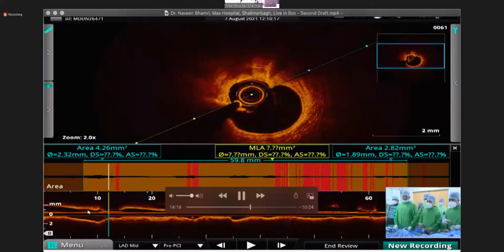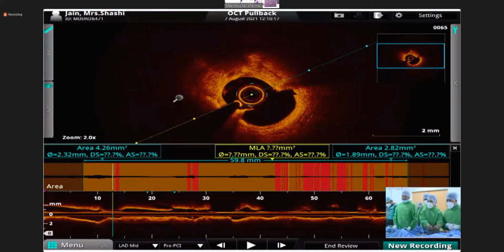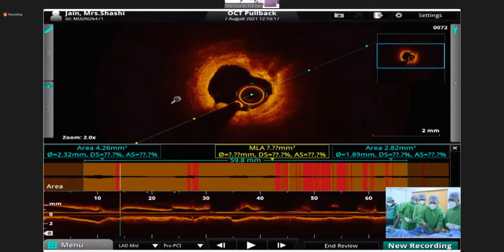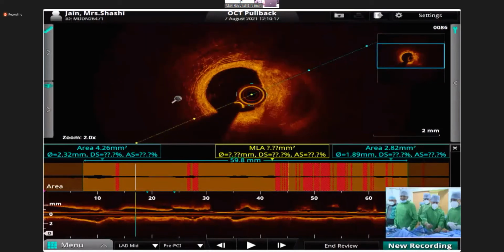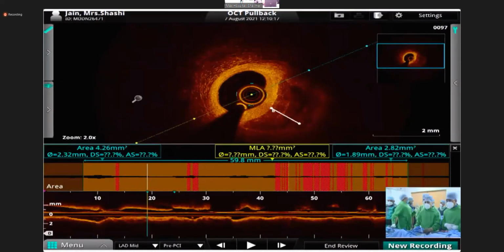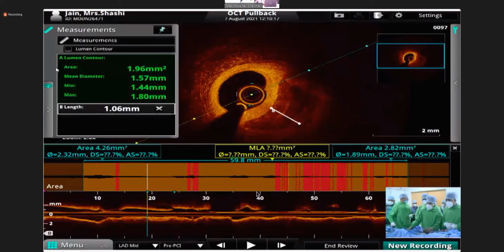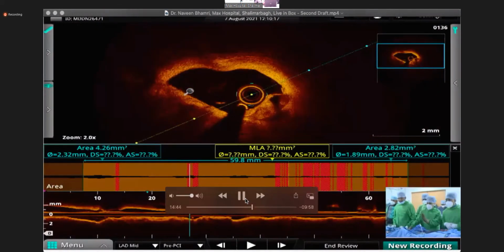You can see the dense calcification from the 9 o'clock to 3 o'clock position. Now you can see the dissections. You can see the length of the calcification is more than 5 millimeter. Depth is approximately 1 millimeter, more than 0.5. Yeah, so a lot of calcium. This is a heavily calcified lesion.